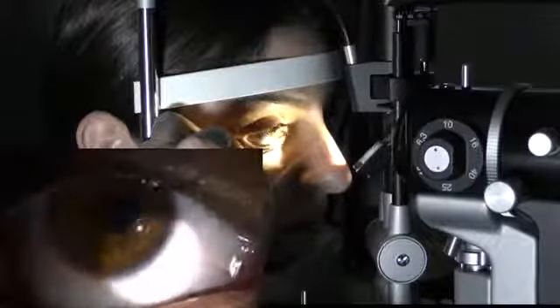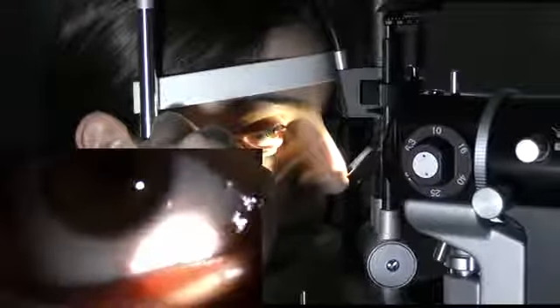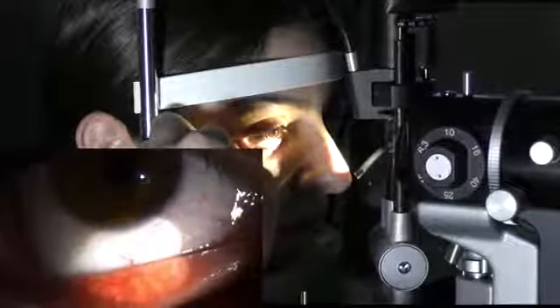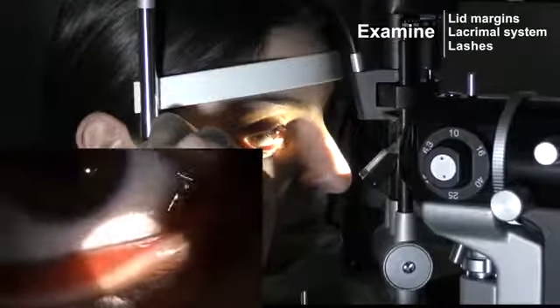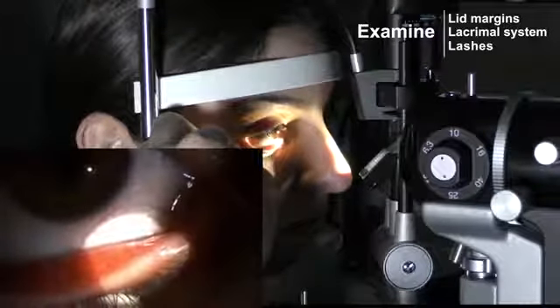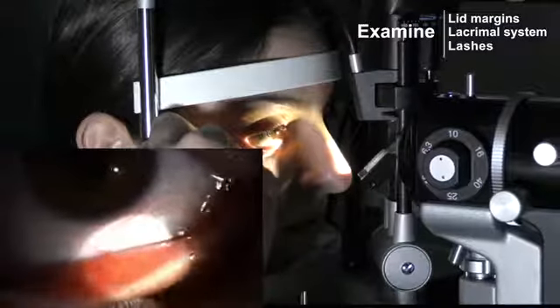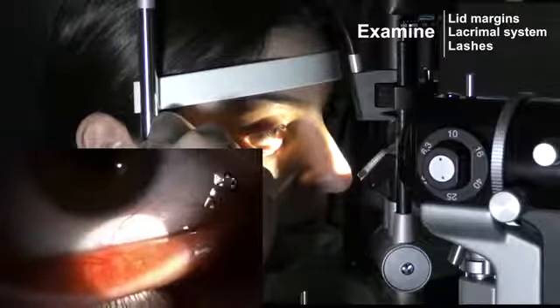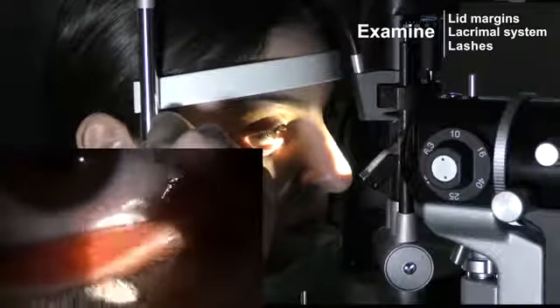And gently pull the lower eyelid down. So now I can actually look at the structures here, okay? Get that in focus again. And so we want to start from outside in. So look at the lid margin, see if there's any erythema, any edema of the lid margin, okay? Sometimes if you have a diffuse erythema or edema, that can be a sign of preseptal cellulitis. Also, if there's a localized area of edema, that could also be a chalazion. So look for that. Look at the punctum, make sure it's open.